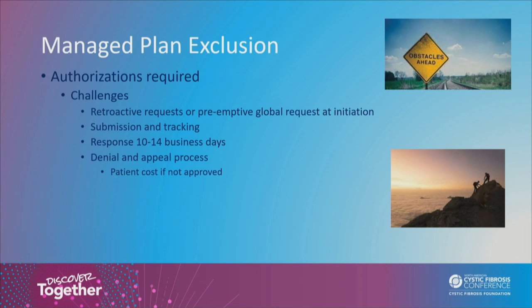I will say that less than 5% of our patients are HMO, so that is important to let you know. And yes, we are still paying for their dashboard cost. So this is a loss to our center for any HMO or managed care plan who might be using their HS device. And again, it's quite tedious if they get denied because you will need to appeal that, and a lot of the onus is back on the providers for us to write medical necessity letters or do a peer-to-peer and justify the use, which obviously can be done.